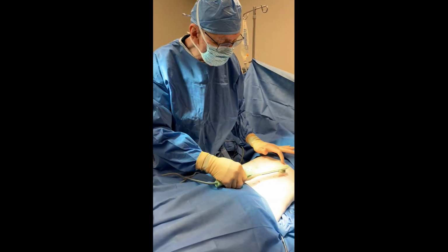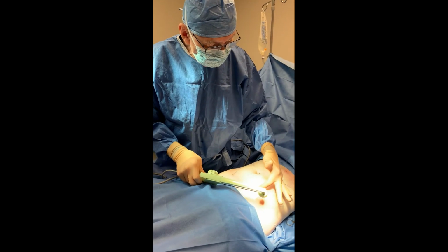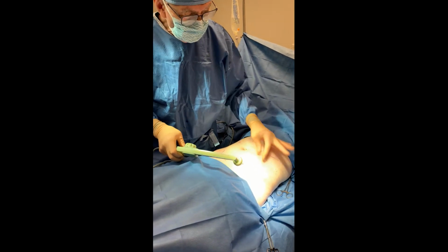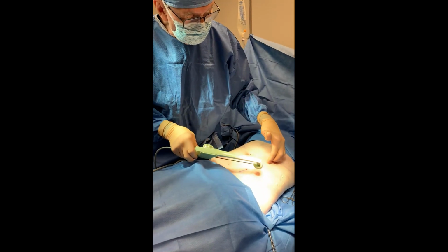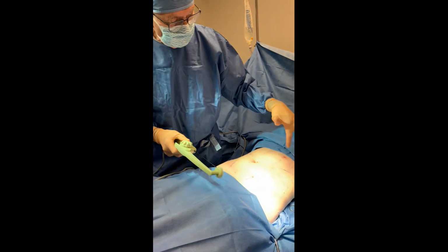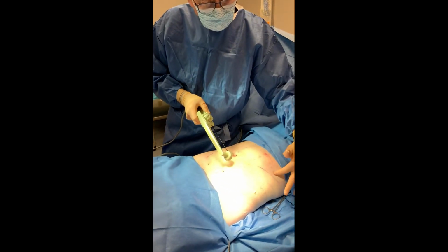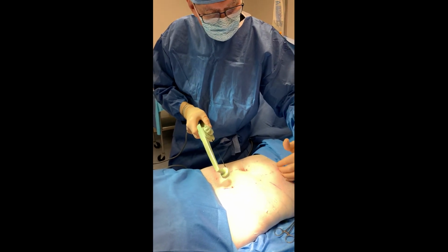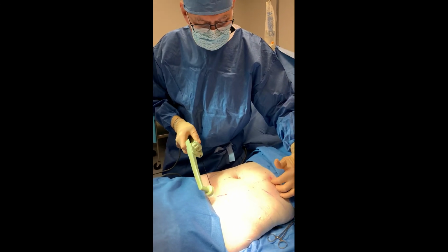And what we're going to do, as I previously marked, is that we're going to define the lateral border of what we call the rectus muscle or the mid-abdominal muscle. We're going to go over the hip area, define that, and define the lateral waist area and the muscles that make up the lateral abdomen. And lastly, we're going to separate the ribs and the chest from the abdomen. So we're going to come to what we call the subcostal area and define this area as well.